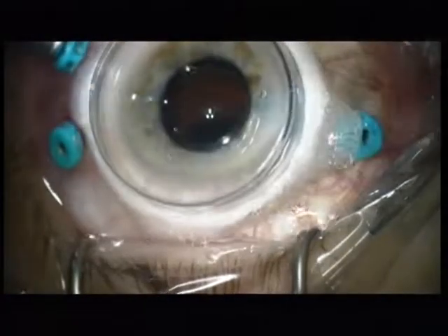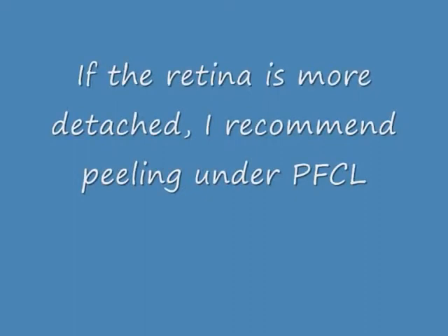Next step is the ILM staining. And again, contact lens. Now watch — this is interesting. You see that the retina is detached. When I'm doing ILM peeling, you see the detached retina. It's a shallow detachment, but it extends far over the inferior arcade. Is this only caused by this VMTS, or is a retinal detachment present?